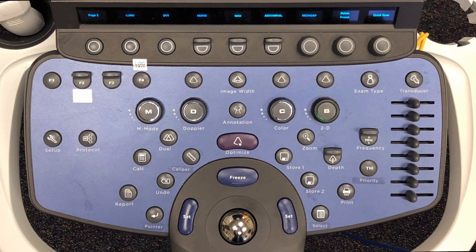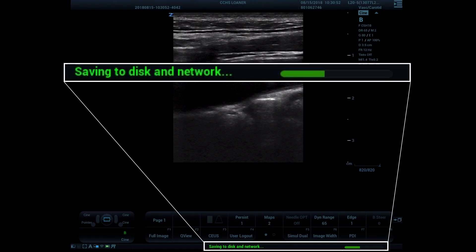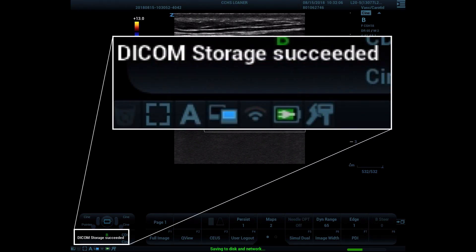Let's review how to save images and clips. The store buttons are set to function the same to prevent confusion. When pressed, they store a 6-second prospective clip if you are live scanning; if you have a frozen image, they capture a still image. When complete, the system will beep to let you know the clip is over. If you press the store button again before the 6 seconds have elapsed, the captured clip will be truncated to a shorter length. The print button will capture a still if your machine does not have a printer attached; if there is a printer attached, it will print the thermal image. When capturing an image, you will see a notation at the bottom of the screen saying it is saving to disk and network, along with the progress bar as the 6 seconds elapse. When an image is captured, it will be stored on the network, and you will see a popup in the lower left corner confirming the image or clip has been stored successfully.